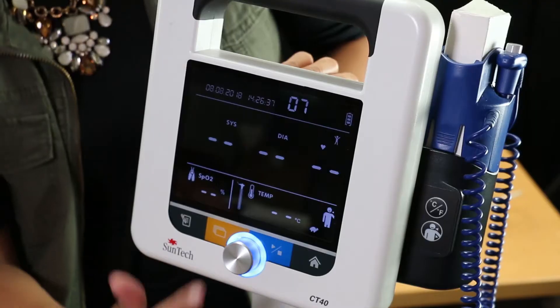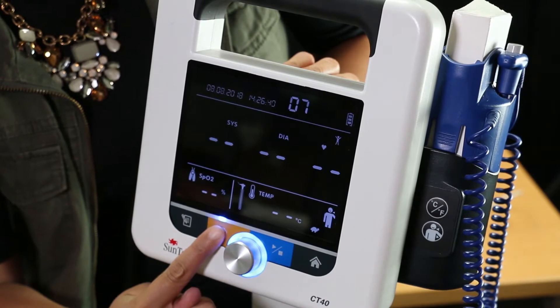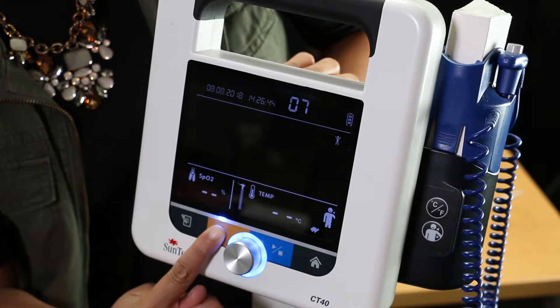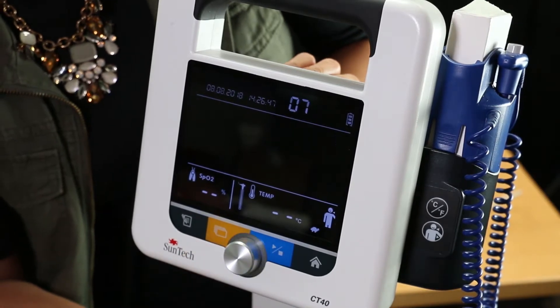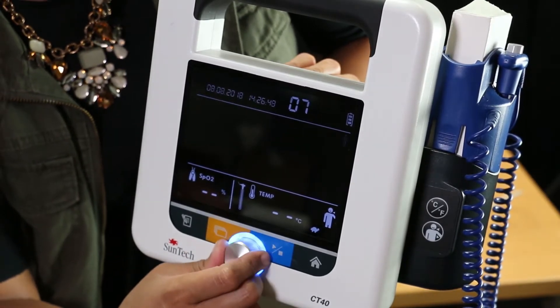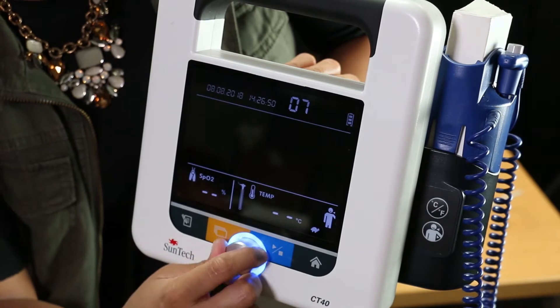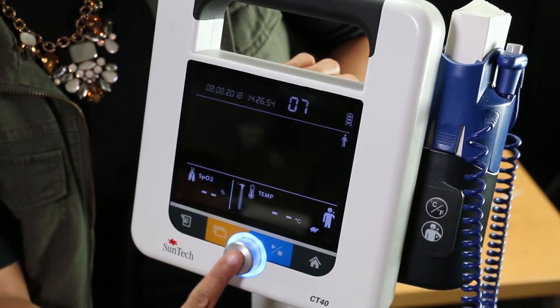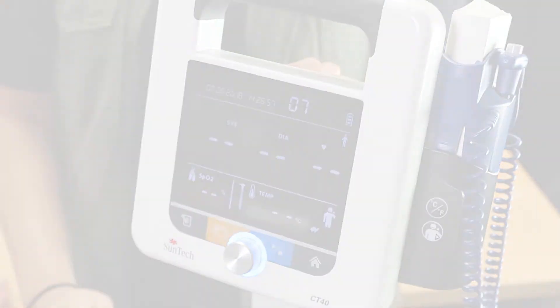The next step is to select between adult or paediatric mode. Hold the toggle mode button down for 4 seconds until the adult or paediatric icons start blinking. Turn the selection knob in either direction to select the desired mode — the selected icon will be the one flashing. Press the selection knob to finalise this selection.